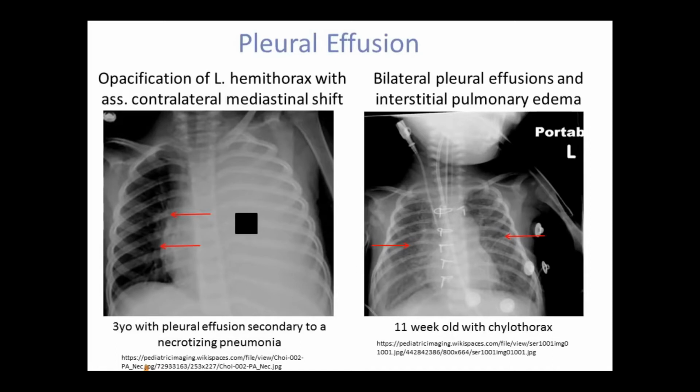Effusions present in the pleural cavity may be an empyema, collections of pus, a hemothorax resulting from chest trauma, or an exudative effusion from a diseased nearby structure, which includes subdiaphragmatic abscesses, pericarditis, and pancreatitis. The only realistic way to differentiate these different types of effusions is to conduct a thoracentesis and pleural fluid analysis.